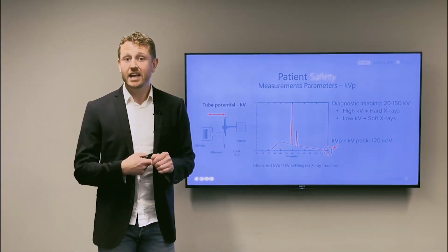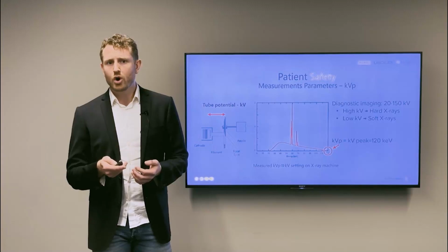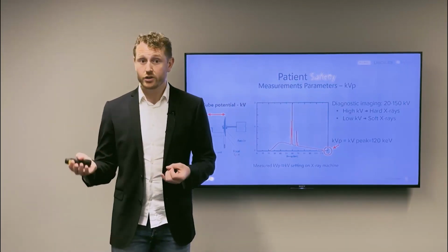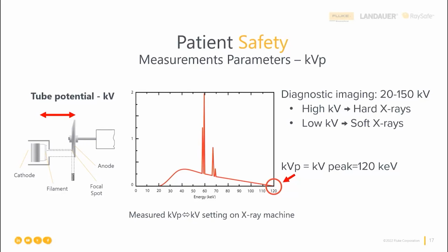If there is a change in the kV on the machine over time, it will affect the quality of the image taken. Most likely, there is something wrong with a controller inside the generator. There may also be worn out circuits, making it hard for the machine to ramp up the kV fast enough. A third option may be that there is a flaw in the power grid.